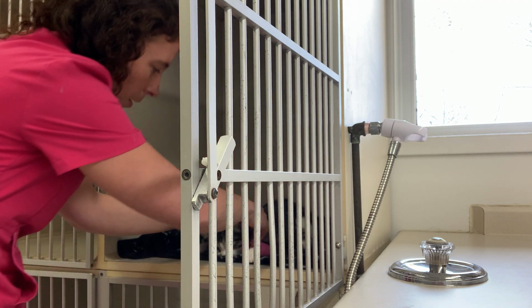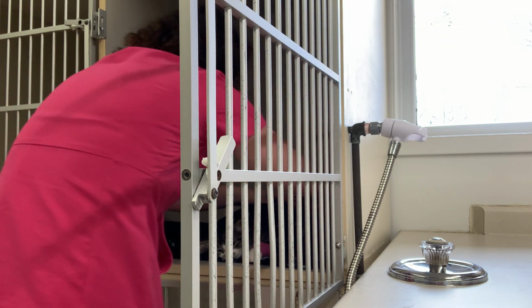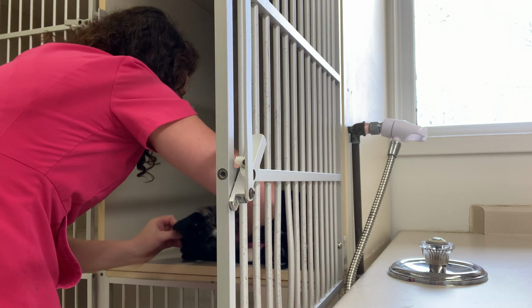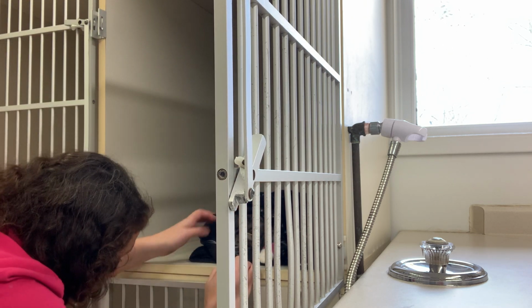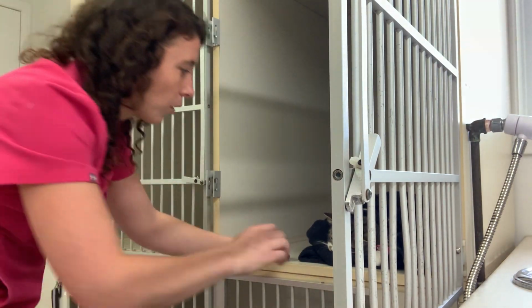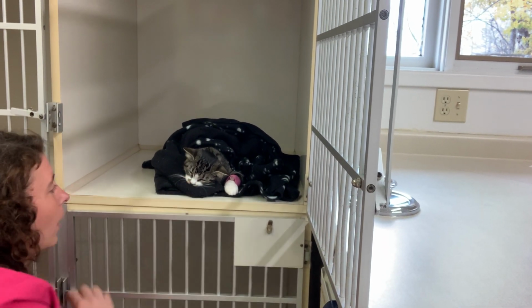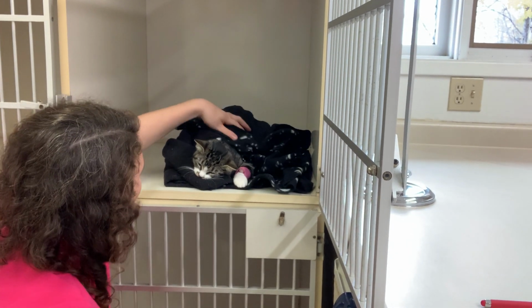We want to prop our patient up, making sure that we consider the patient's warmth. You want to make sure that you've got a really nice, toasty, warm patient. And you're protecting the patient's airway if they can't, which is what the endotracheal tube was doing. But now, you can see we do have a palpebral reflex that has returned. Can you just adjust the camera so it's over here? Just pull that in behind me there. Just like that. You can see we do have the palpebral reflex that has returned. And our cat is nice and snuggly, nice and warm in the blankets here.